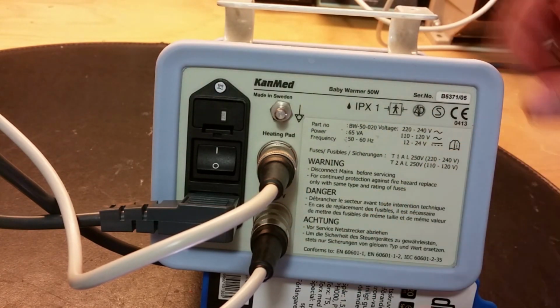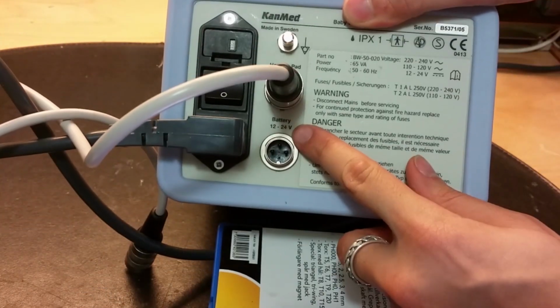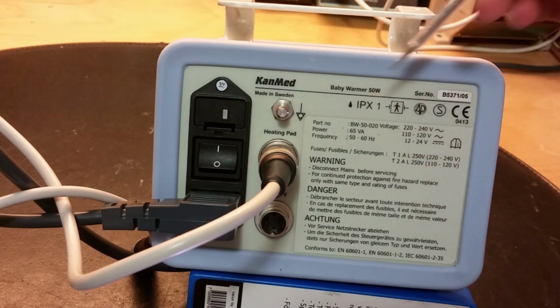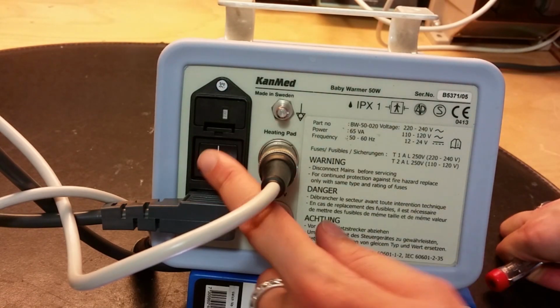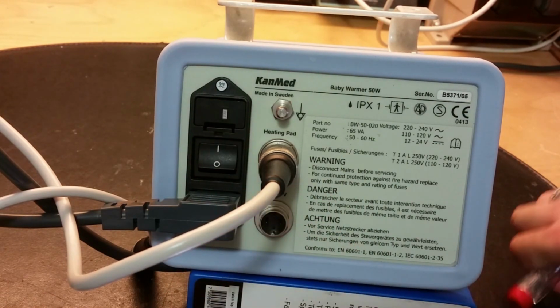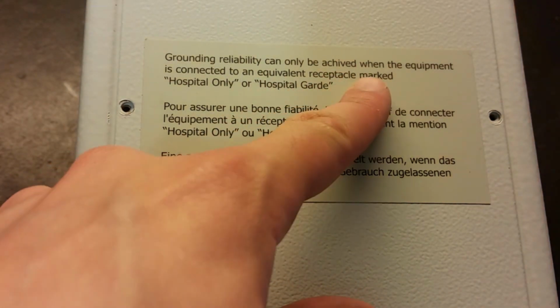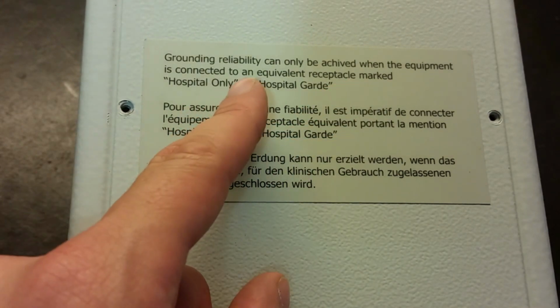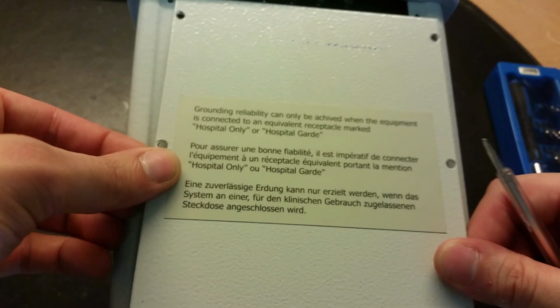And we're actually using this connector on the bottom here that goes to the testing panel. And yes, here we got battery 12, 24 volts. And this goes to the actual heating pad, and that's the test wire as well that goes to this thing that I just showed you. And up here we got a selector switch. On the back here it even says that ground reliability can only be achieved when the equipment is connected to an equivalent receptacle marked hospital only or hospital grade. And they're of course meaning that ground tap here. Let's open it up. Here we go.